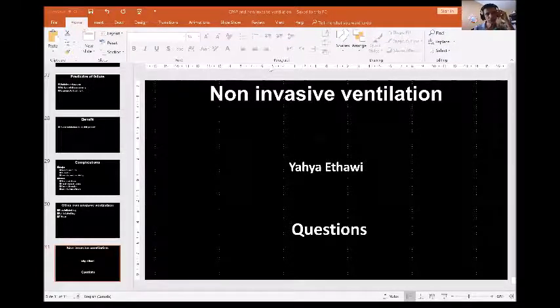In case of burning, I think the spelling is wrong, but I think you're talking about burning. If there is a burn around the nose and it's severe, it can cause infection, it can cause more pressure, it's better to intubate and ventilate. Yes, you can use minimal non-invasive ventilation without sedation, if the patient tolerates it. If the patient does not tolerate, you have to use one of the three options that I've told you.